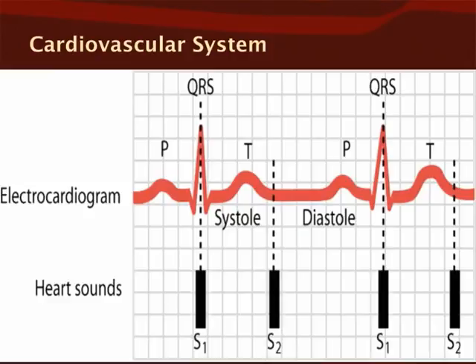The P wave represents the depolarization or contraction of the atria. A normal PR interval is a normal impulse conducted from the SA node in the atria through the AV node. It means that it made contact with the atria on the way down, and it followed a regular, unobstructed course.